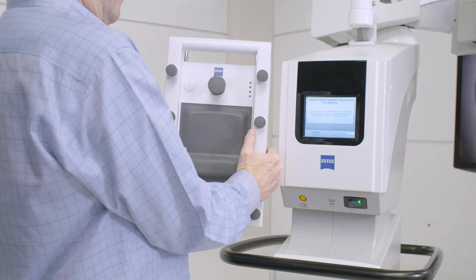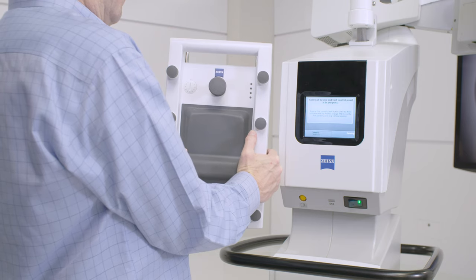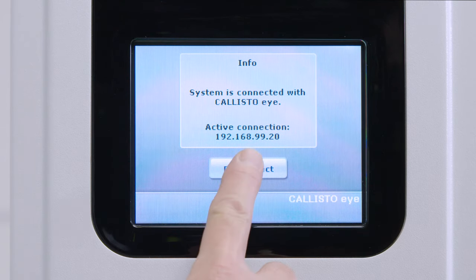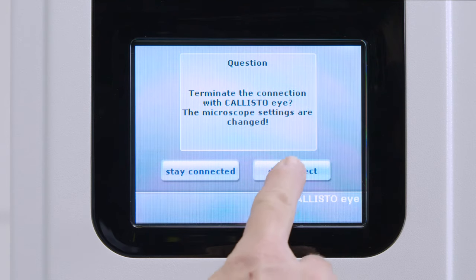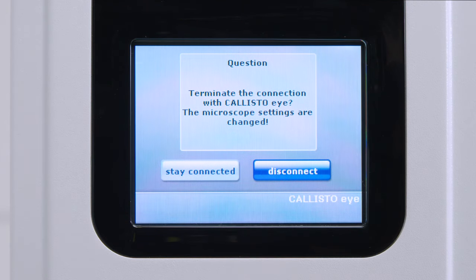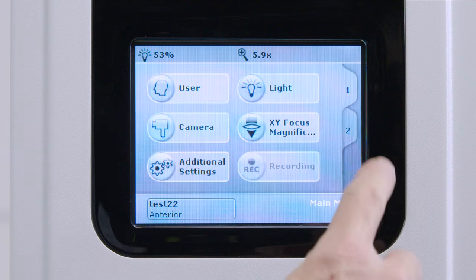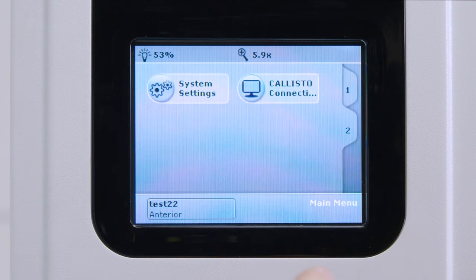Holding the foot control panel in the vertical position, start the pairing process. If you are pairing an Artevo 800 or any system with a Callisto Eye, first press disconnect on the main touch screen and then again to disconnect Callisto Eye. On the Artevo 800 or any OPMI Lumera system with Callisto Eye, you are now on tab 2. If you are on an OPMI Lumera 700 without Callisto Eye, you are now on tab 1 and need to select tab 2 on the right before proceeding.